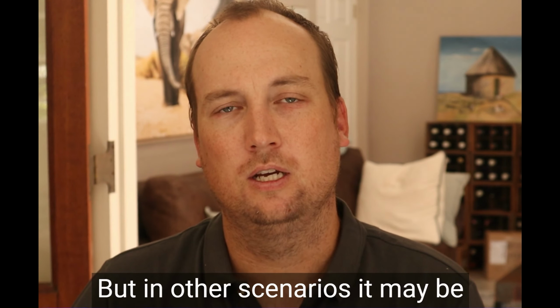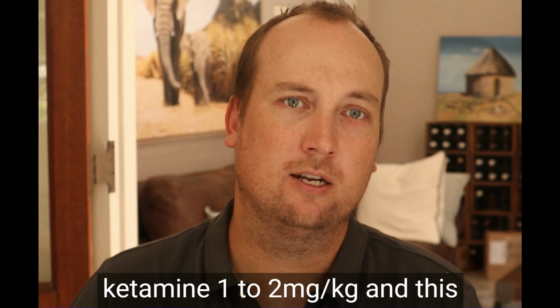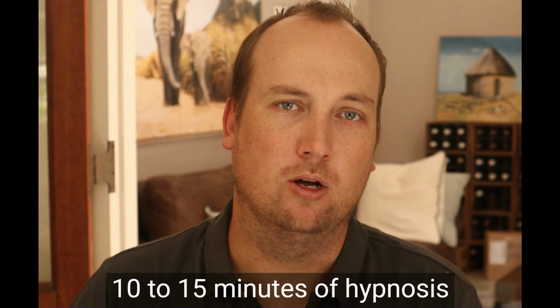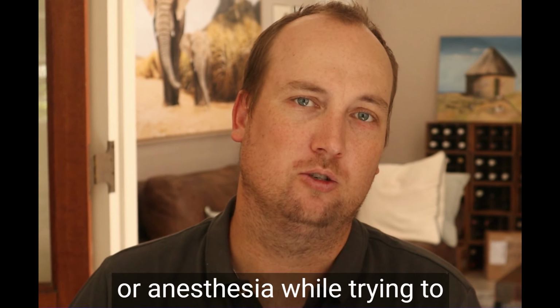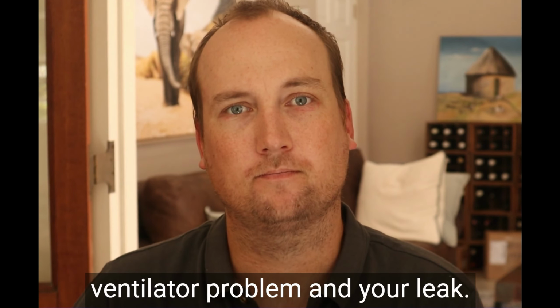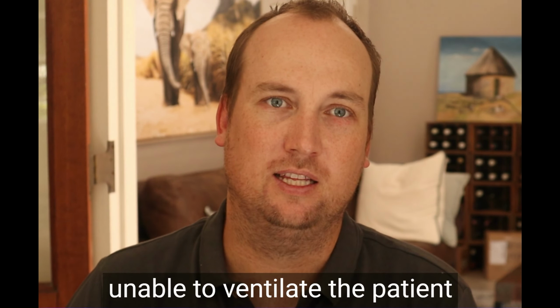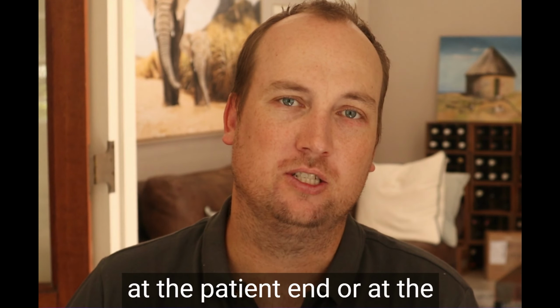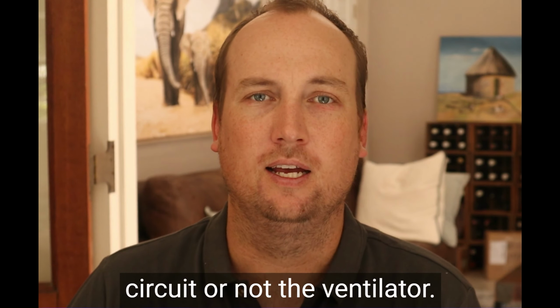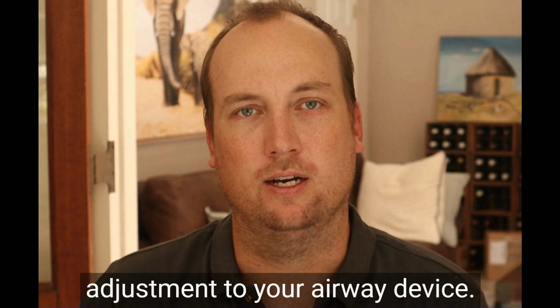But in other scenarios it may be more prudent to give a bolus of ketamine, 1 to 2 milligrams per kilogram, and this would afford you probably around 10 to 15 minutes of hypnosis or anesthesia while trying to work out a solution to your ventilator problem and your leak. If when you switch to the AmbuBag to ventilate, you are still unable to ventilate the patient, then the leak is happening at the patient end or at the airway device, not the breathing circuit or the ventilator. And so you have to re-examine the patient or make a rapid adjustment to your airway device.